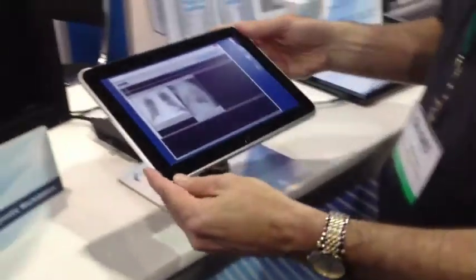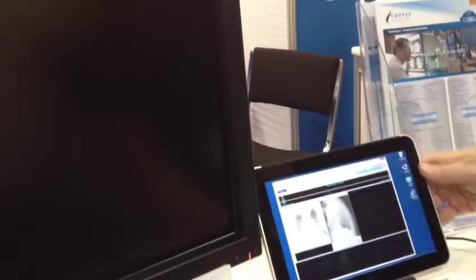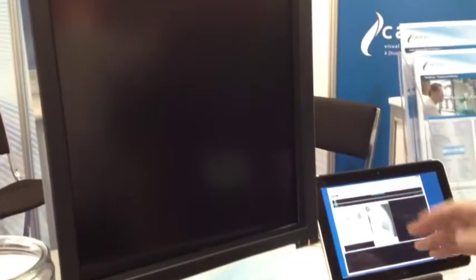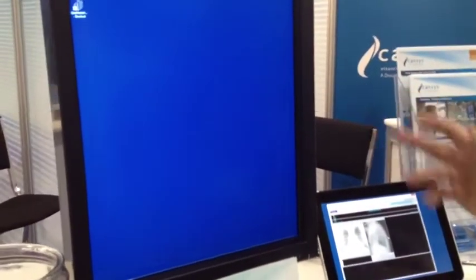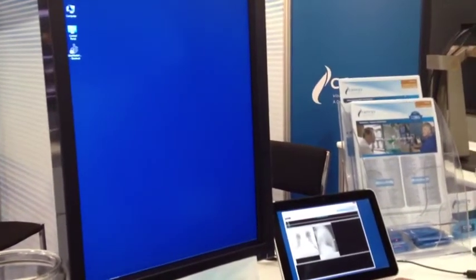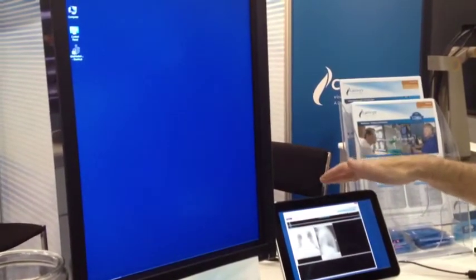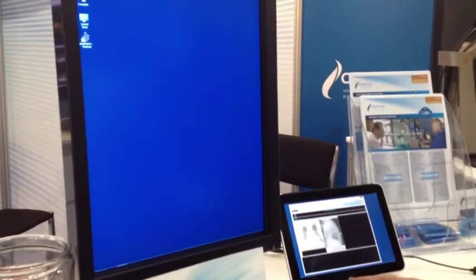What I can do is put this tablet into its docking station, which is connected to an Image Systems 2 megapixel diagnostic workstation. This diagnostic monitor is being driven by the tablet and is fully calibrated to DICOM.